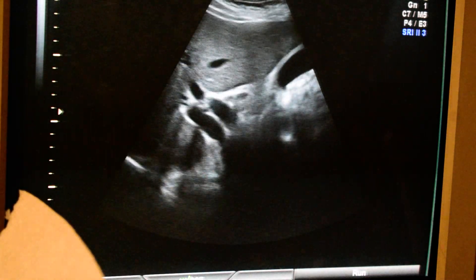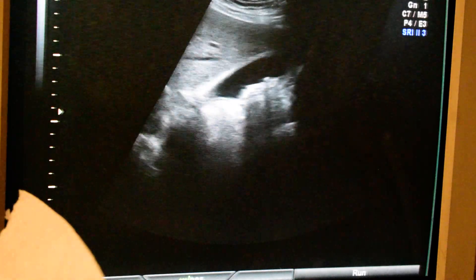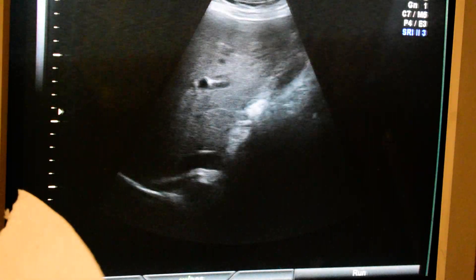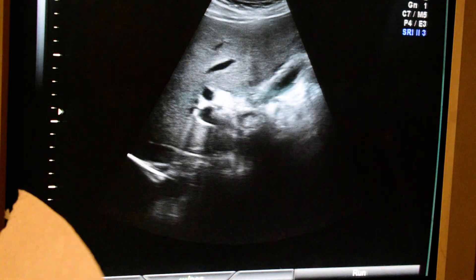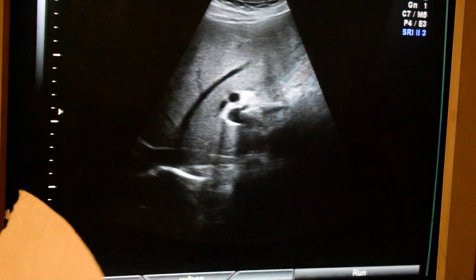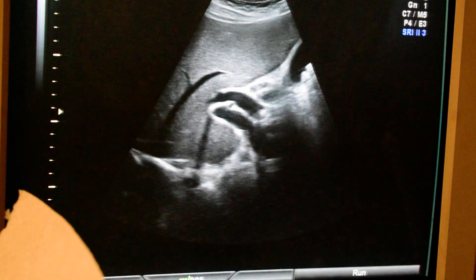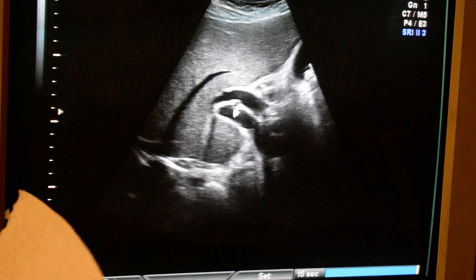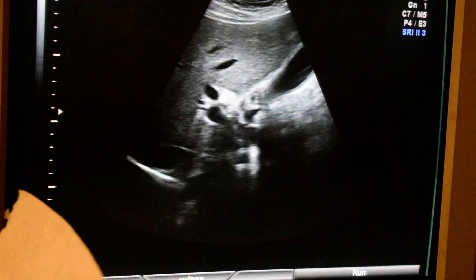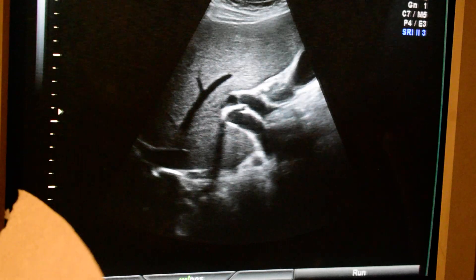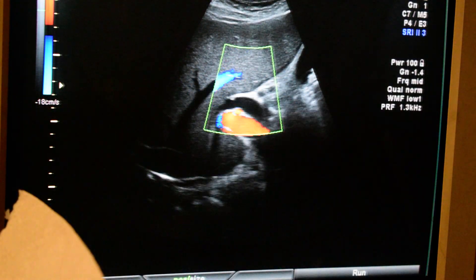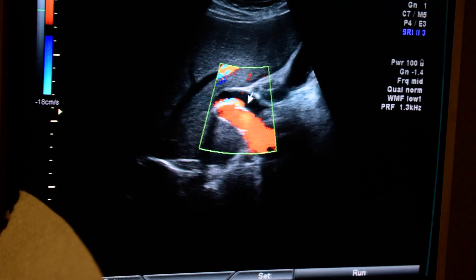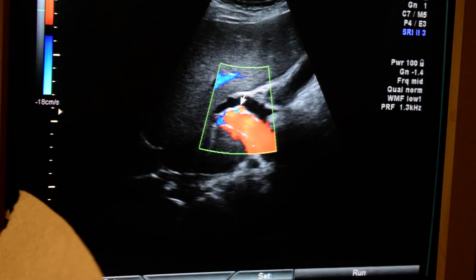There is a case of gallstone with signs of inflammation, mostly chronic inflammation, because the patient is stable. We can see the dilated common bile duct — here is the common bile duct and this is the portal vein. You can distinguish them if you apply the Doppler: this is the portal vein, and the common bile duct is colorless.